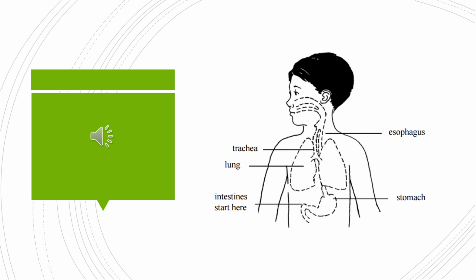A gastric feeding tube, called a G-tube, is a tube inserted through a small incision in the abdomen into the stomach and is used for long-term enteral nutrition. Gastric feeding tubes are suitable for long-term use, though they sometimes need to be replaced if used long-term.